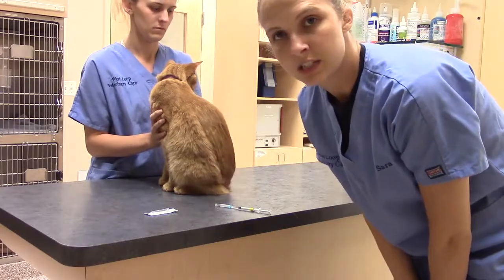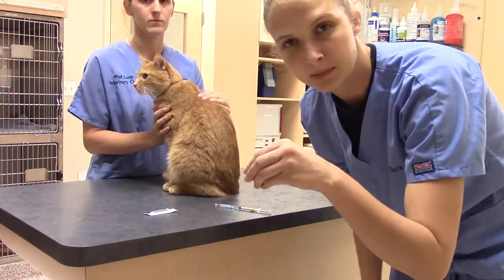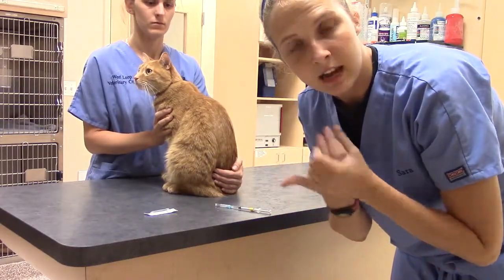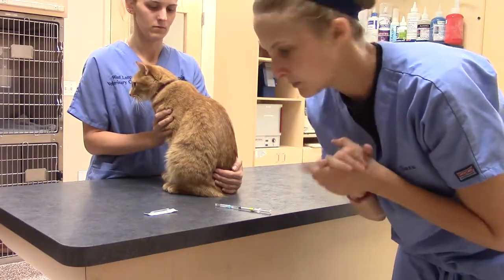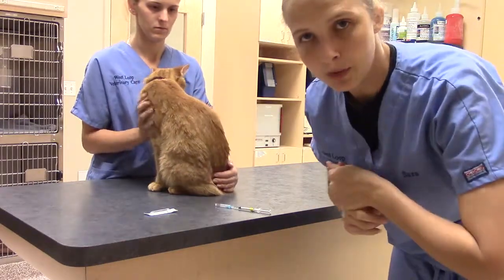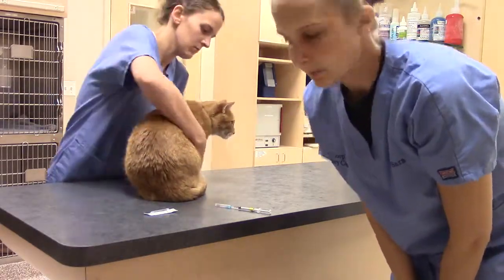My helper is going to make sure she's keeping a hold on him. When I go to do the sub-Q injection, I'm going to pull up the skin to make a little tent, insert the needle, and pull back to make sure I don't get any blood, since this isn't going to be an IV injection. As long as I don't pull back any blood, I'll go ahead and administer the medication. We usually like to do it between the shoulder blades — interscapular — just because there's a lot of extra skin there, making it easier to manipulate versus along the spine.